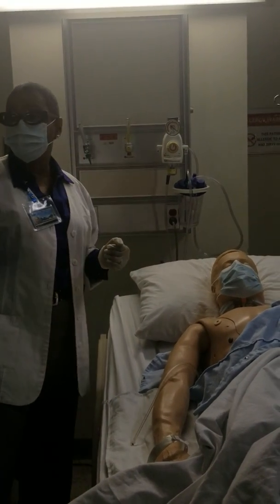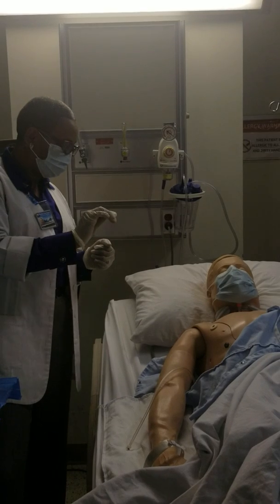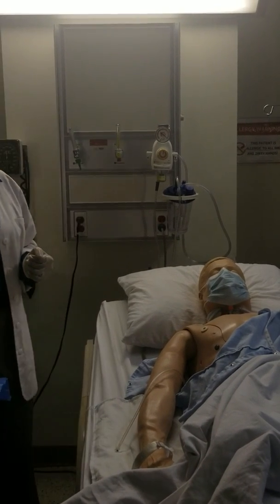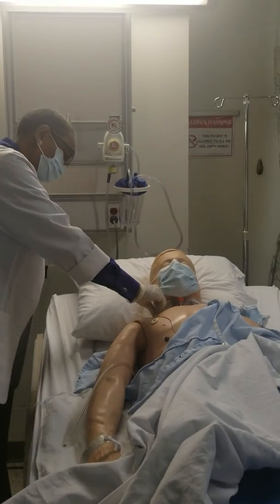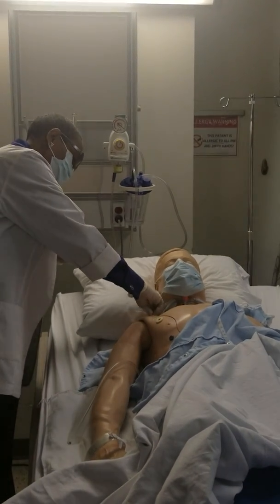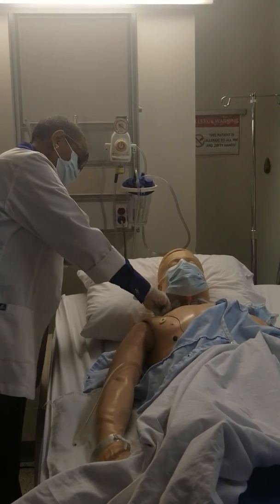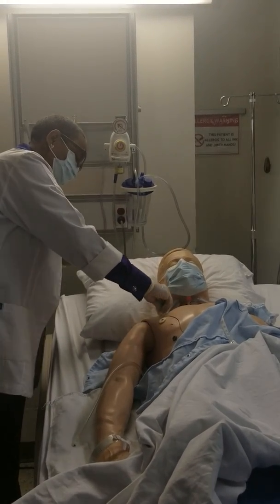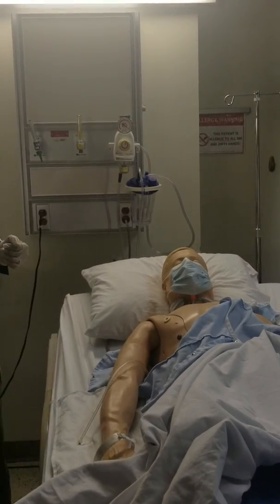So then you do what? You want me to blow on it to let it dry? No, let it dry for 30 seconds. You gotta let it dry, so you let the patient know. Some people, to speed it up, we're going to go ahead and dry this site, but not in real life. Not in real life, you just got to let it. And not in check off. So don't make it too wet. I made mine very wet, but you gotta dry the site, because otherwise we ain't going to get through this.